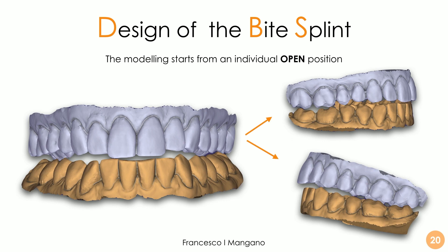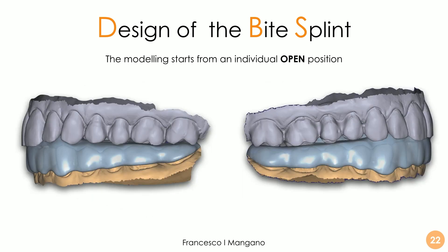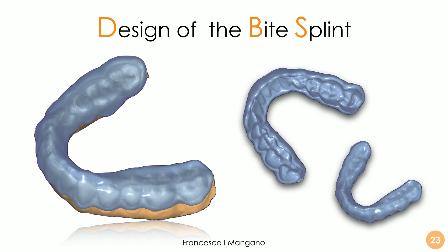It's a position that the patient has during the movement — it's completely natural. And here with dynamic bite splint modeling, frame by frame, the dental technician can clearly and accurately check all the contacts and design the bite accordingly. It is a bite that will need zero adjustment when it is delivered to the patient, when it is applied clinically. Here the lateral view, right and left view, and here the bite itself.